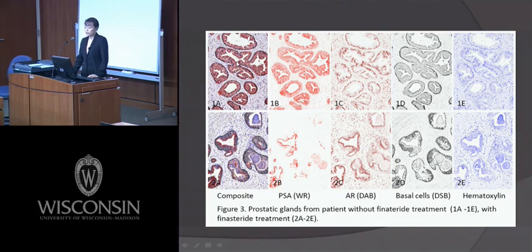In the top one, you see more prostate epithelium. And here, there is more stroma. And you can see the dark one defined by cytokeratin CK5. That's basal cell hyperplasia. So from morphology, you can see there is a difference in the two groups. But by eyeballing it, it's very hard to really precisely quantitate that.